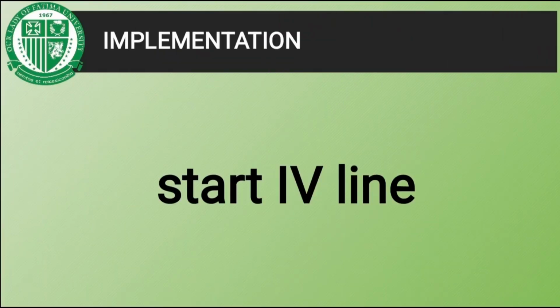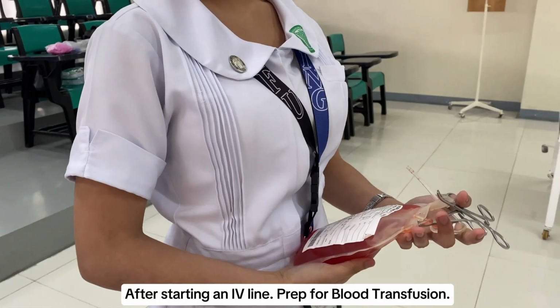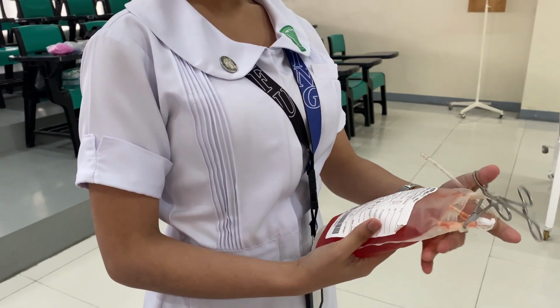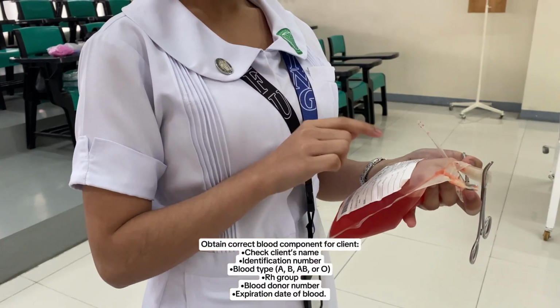Starting the IV line. After starting an IV line, prepare for blood transfusion. Obtain the correct blood component for the client.